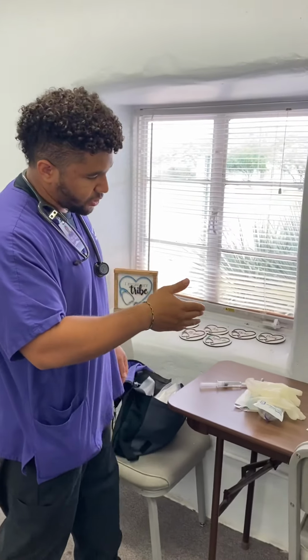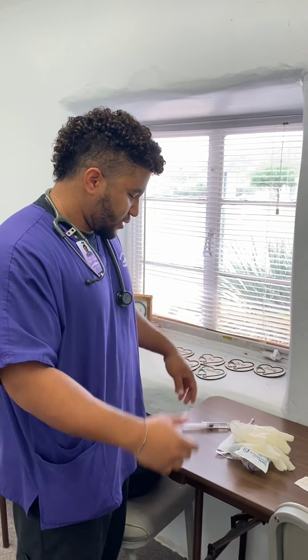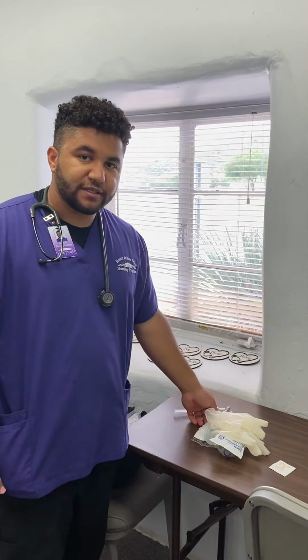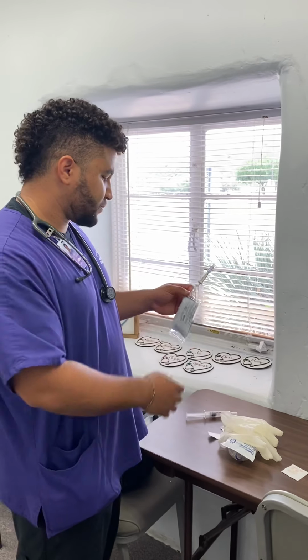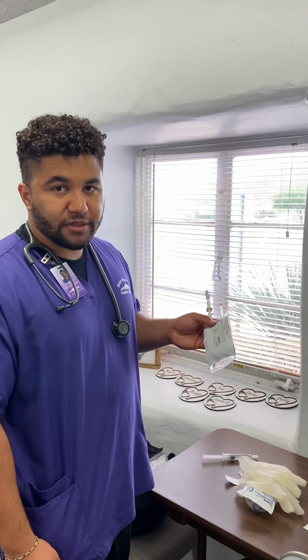So today we're going to go over a secondary line for IV. The first thing you need to do is check the chart or the computer for the doctor's order. He has ordered ciprofloxacin for a patient. Let's go check. It is for 200 milligrams and 100 mLs.